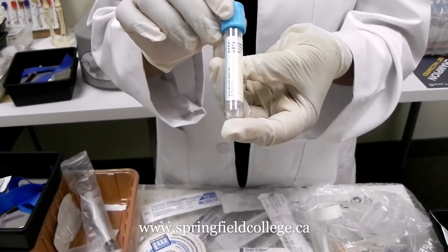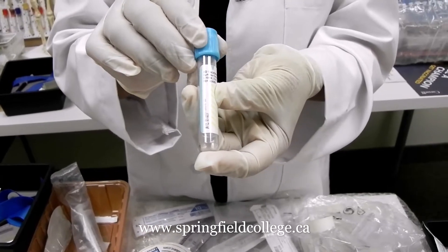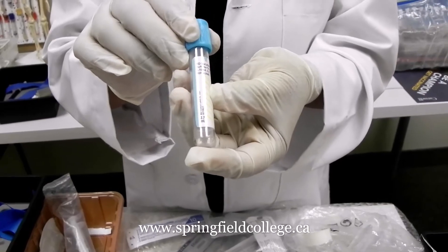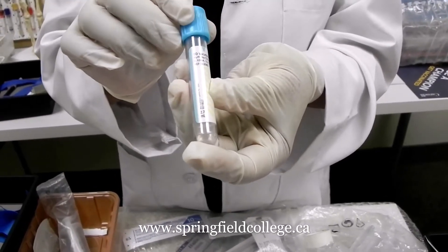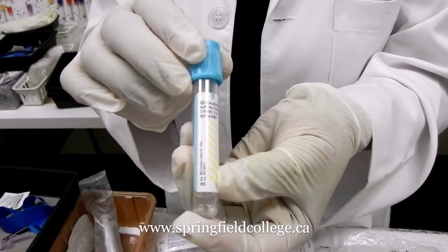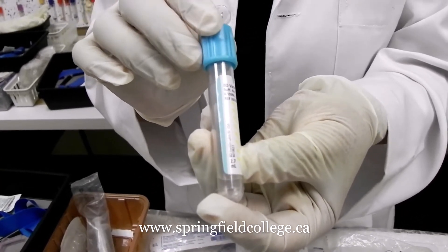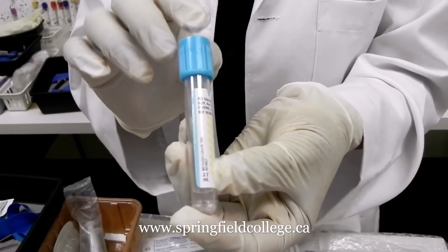We use this tube for INR mainly. Then we use it for PT and all — we can say for the clotting studies. This is also commonly used for fibrinogen and D-dimer tests. So those tests can also be performed with this one. This is the first tube in a series for the multi-draw.